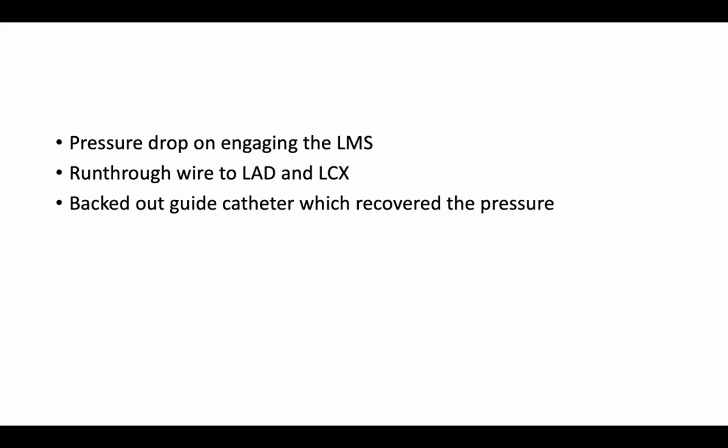So you mentioned angiographically. Now obviously angiography is a combination of fluoroscopy as well as hemodynamics, and the information that I deliberately withheld initially was, as soon as we engaged the guide, the pressure plunged from 90 systolic to 50 systolic on the invasive monitor. So we had to withdraw the guide and then float 2 run-through wires into the LAD and the circumflex, and then backed out the guide, which recovered the pressure.